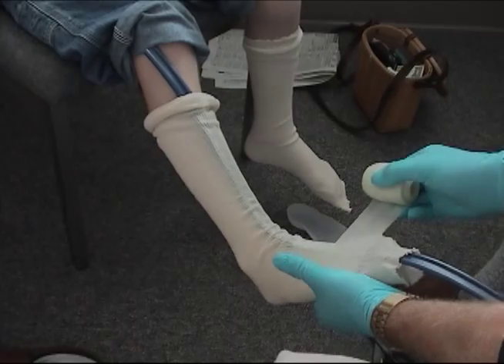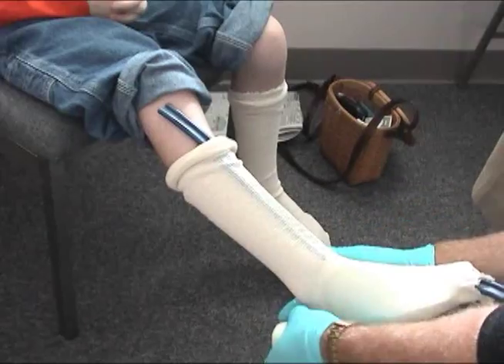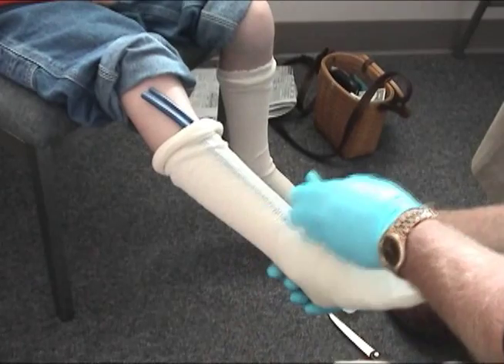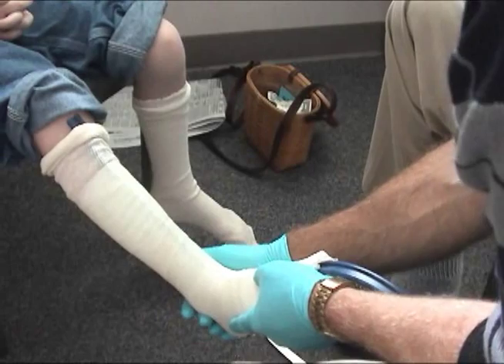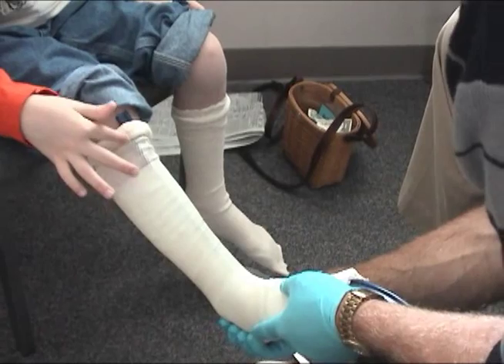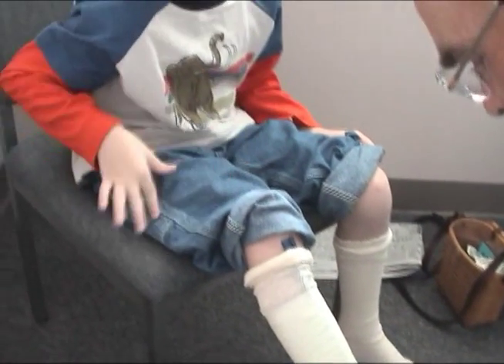Casting Adam for his number twos is very straightforward. He's a good candidate for the cascade footplate system. The footplate system should impart the definition to the plantar surface that will enhance the sensory feedback to Adam as he wears the finished DAFO. During the casting, I manipulate the foot both for its frontal plane alignment and for the sagittal plane alignment of the ankle. I always like my cast to be as precise as possible to the finished position for the planned brace, as any alteration tends to diminish the accuracy of fit.